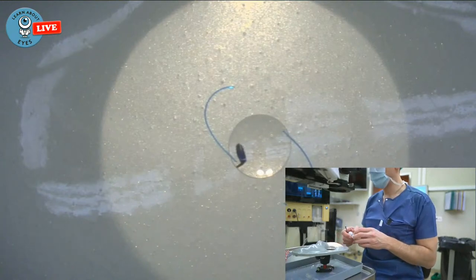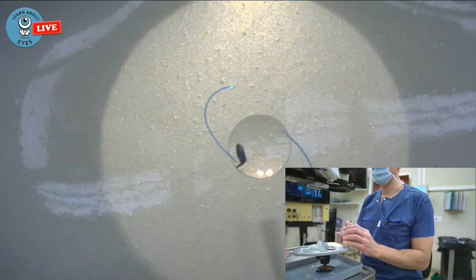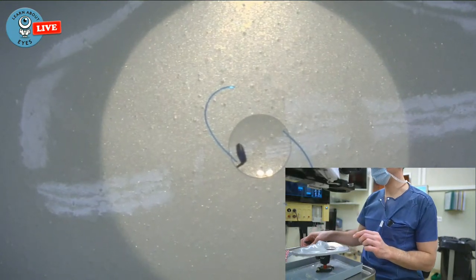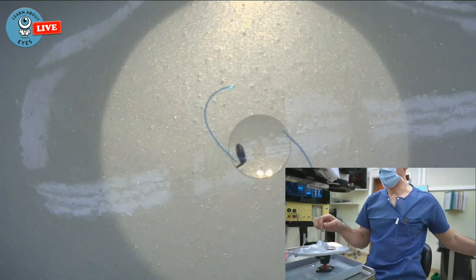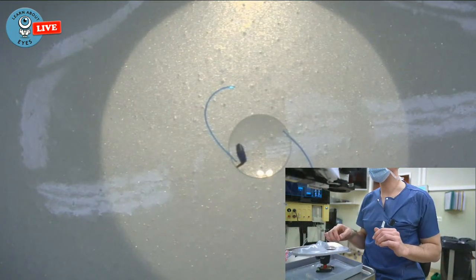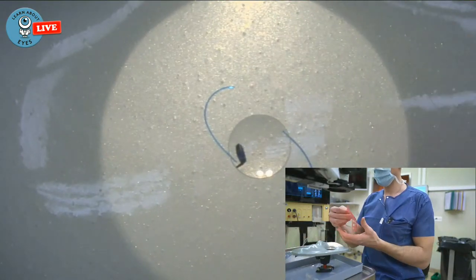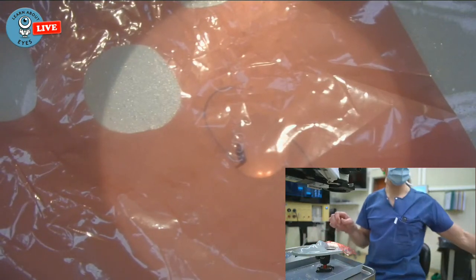And what I just thought about is we could use a bit of Visco to glue it onto there. And first I'm going to, this is as far as I get. First I'm going to cut out a piece of that foil.